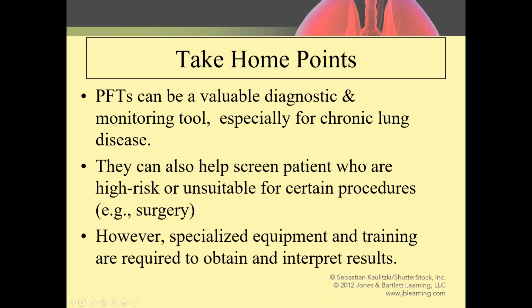So some take-home points: pulmonary function testing can be very valuable. It is a monitoring tool, especially for patients with chronic lung diseases, to monitor how severe their disease is. And a separate but related point is, if they've had serial pulmonary function testing, how much worse it has gotten, how their disease has progressed, if you will.